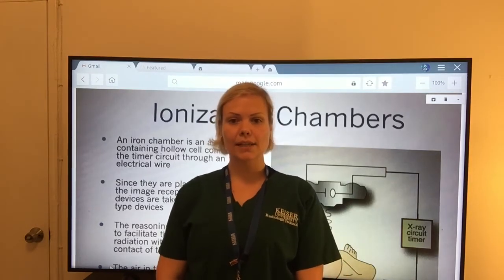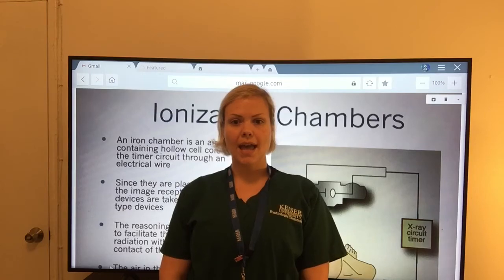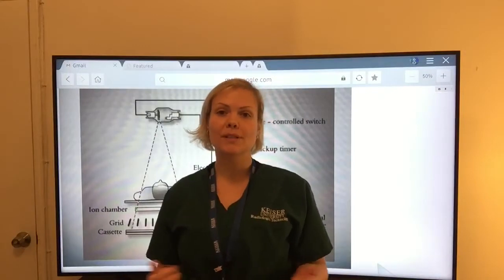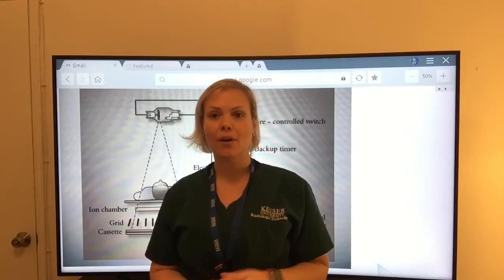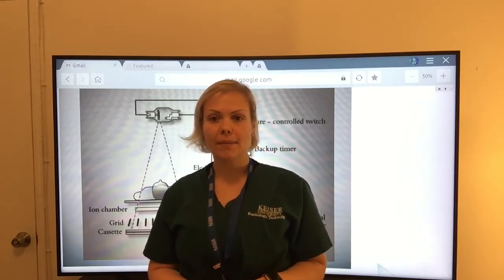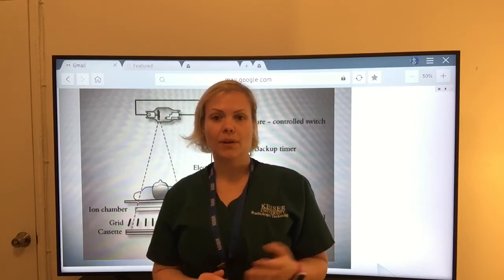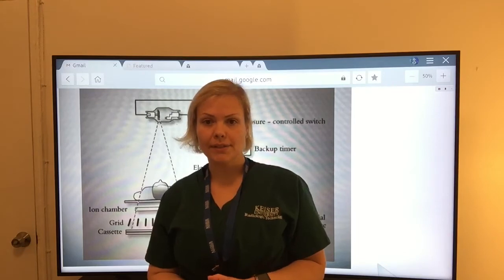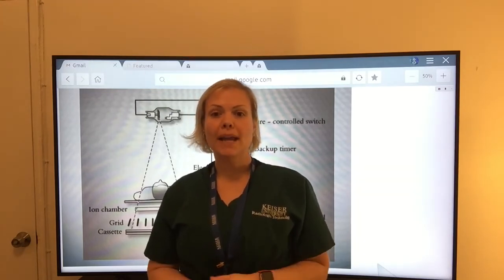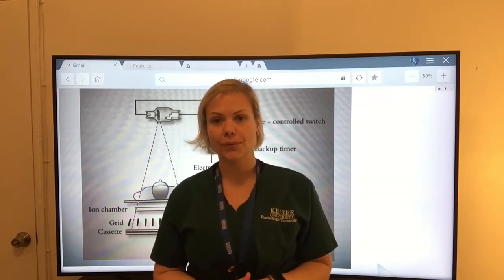The air in the ionization chamber becomes ionized when it's exposed to radiation from a radiographic exposure and electronic charge is created. Minimum response time is the shortest time of the exposure that the system can generate. The minimum response time is often longer with an AEC system than with other classifications of radiographic timers. With a modern AEC system, it's usually 1 millisecond.